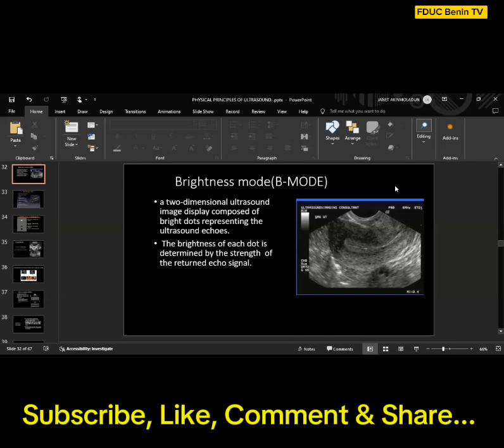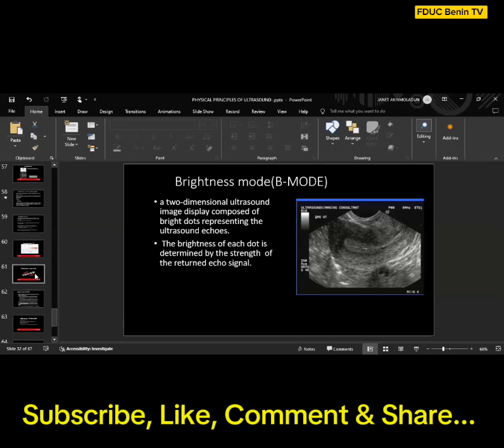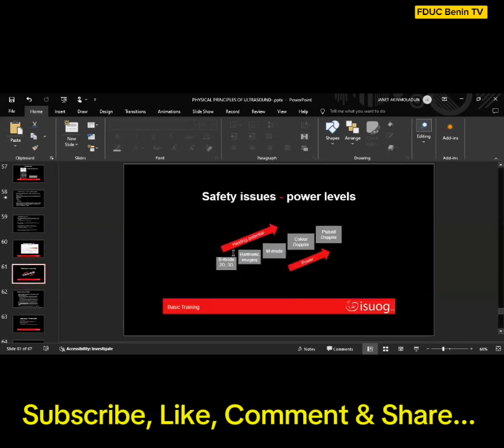So it's not advisable to use it in early pregnancy. So M mode, I used to see my screen. Yeah, I'm seeing it. So this is just showing this. This is one, just safety issues.